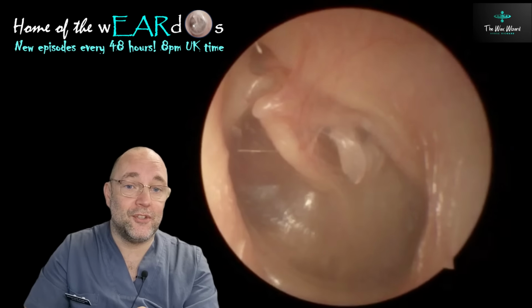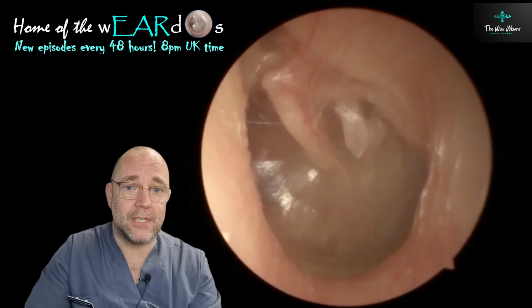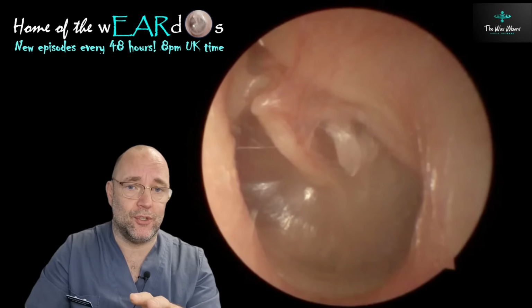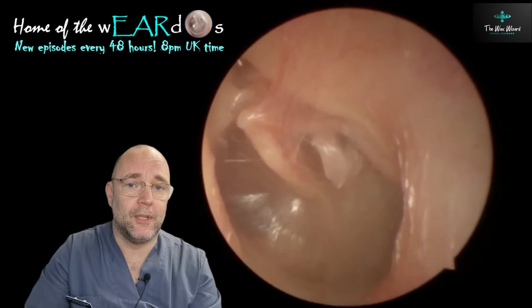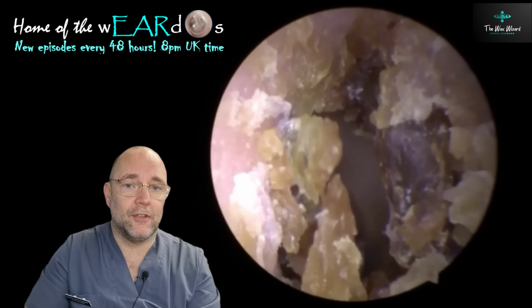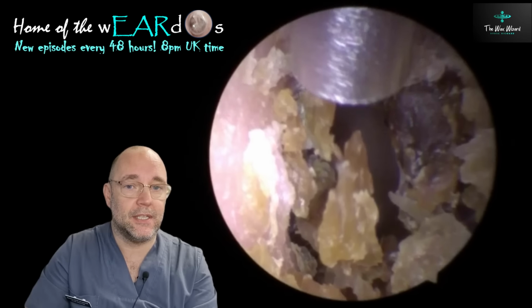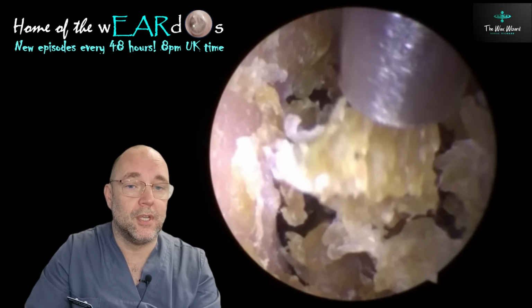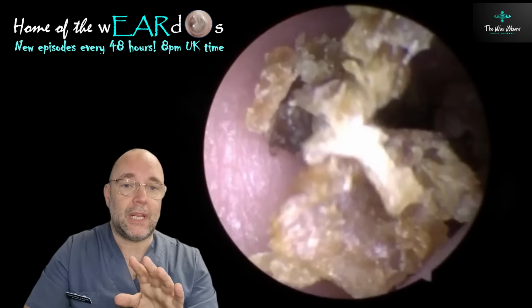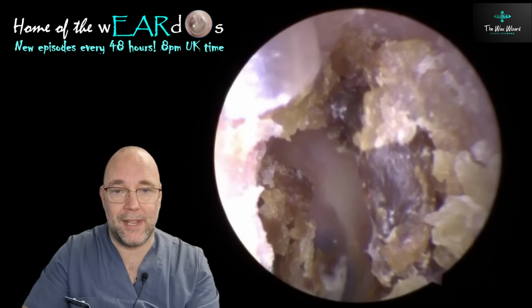This is the other ear, and as you can see, that is just as retracted as well. Now, what's causing that, I don't entirely know, but this is why you send things to the specialist to take a look at. But you can just see how tightly wrapped around the bones it is, and like I said, a little pocket there at the top left-hand corner, which I don't like the look of. Obviously, you can get cholesteatomas collecting in there. I'm not sure whether there is at the moment, but it's got the potential with it being so retracted. Next one, I'll briefly tell you about that, and then I'll get on to what's happened here.